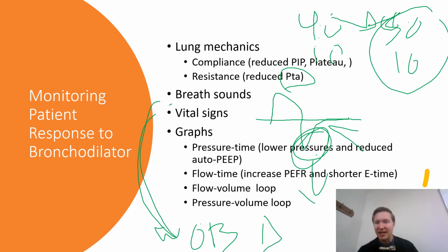I might pick an MDI. If I don't want to break a circuit because they're very, very prone to airway collapse and they have something like ARDS or something where they're already at high risk for infections, they're immunocompromised, I'm worried about their ability to trigger a breath because their respiratory muscles are so weak, maybe a vibrating mesh is where I go, right? Maybe those are all things that I need to consider going into this.